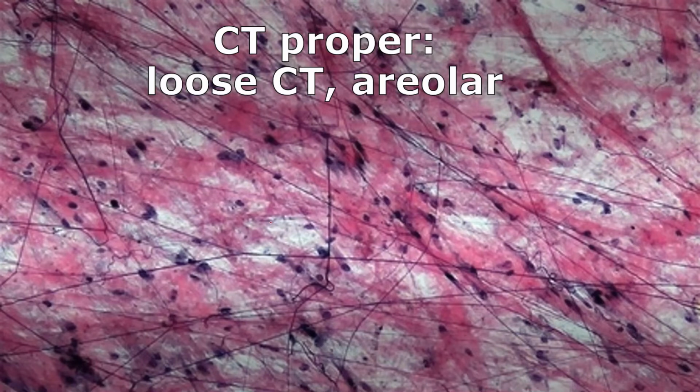Again, what are these fibers? Well, they're probably elastic fibers. They may be collagens in the background. Some of these broader pink things way back here may be collagen fibers. And then the black snakes would be elastic. I see a lot of fibroblasts, again, fibroblast nuclei, and a lot of white space, right? We can drive through this tissue. It's got so many empty holes.